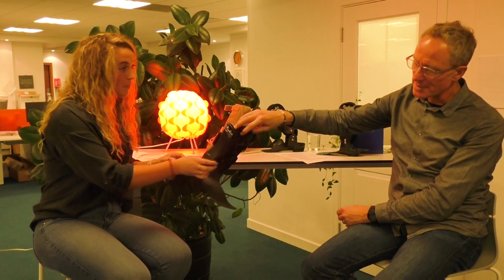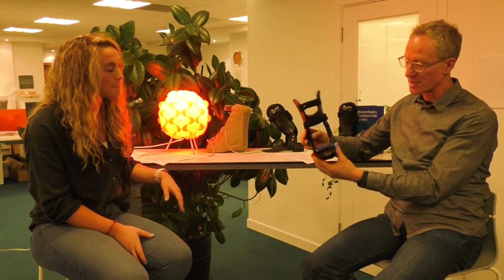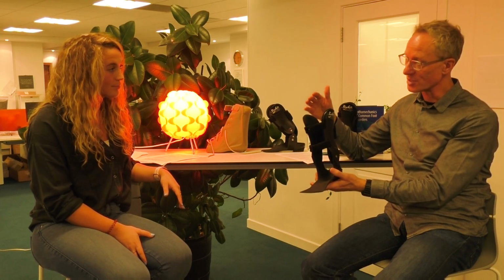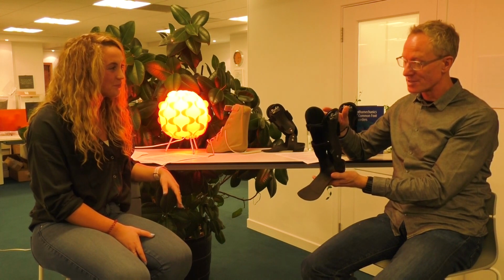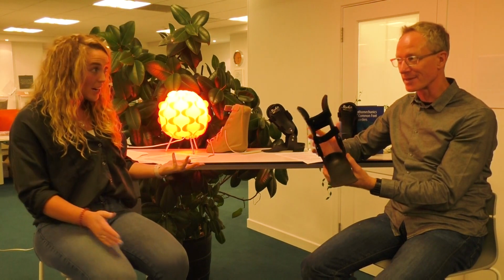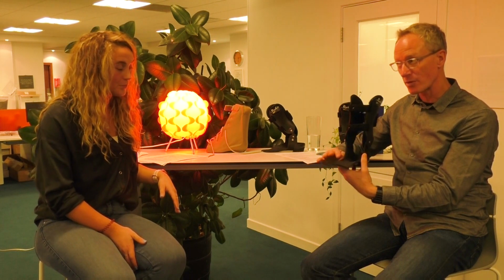Yeah, you've just reminded me that one of the really important things is that when you get a Richie Brace back for fitting, you put it into the shoe and then you put the patient's foot into the shoe. Some people will send us photographs of a Richie Brace on a foot on the ground, not in a shoe. So the shoe is really important. Part of the treatment plan. Correct. Yeah. So the shoe acts as a lateral buttress, particularly for the transverse plane problem that we see with adult acquired flat foot.